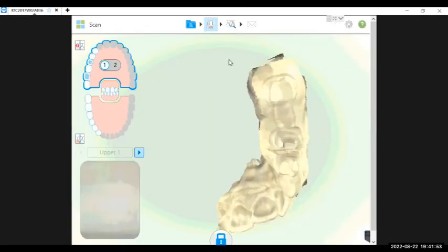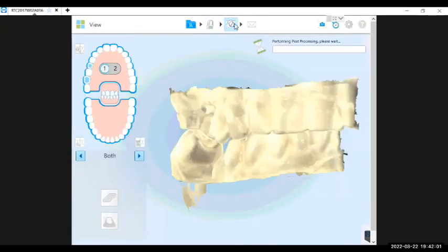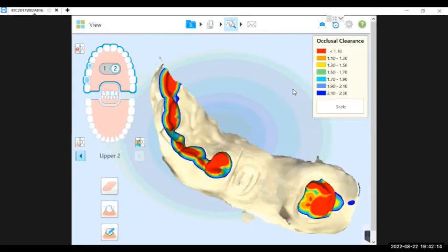That was perfect. We just had an inquiry about the margin marking tool. Yay! Okay, just want to make sure I got everything. Okay.